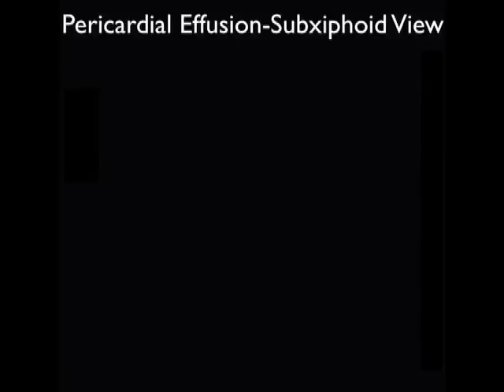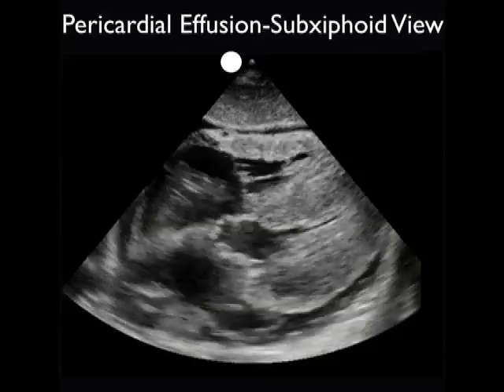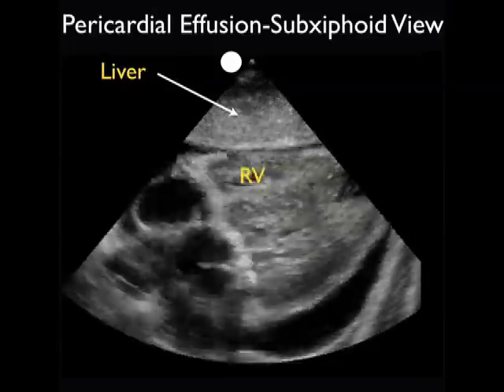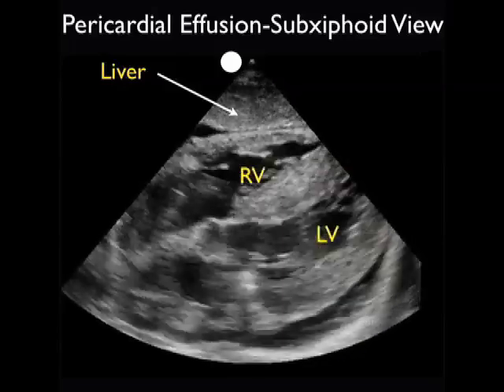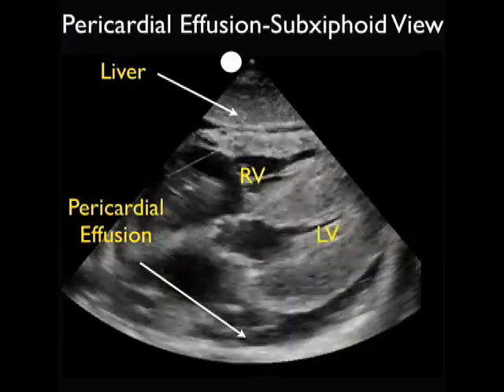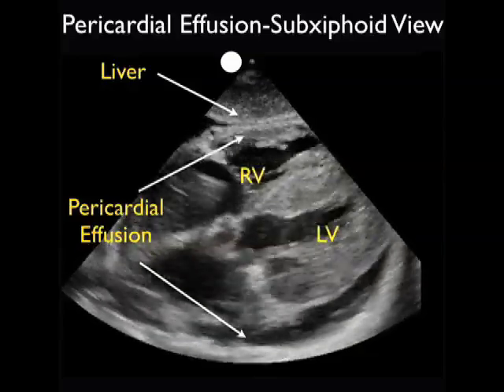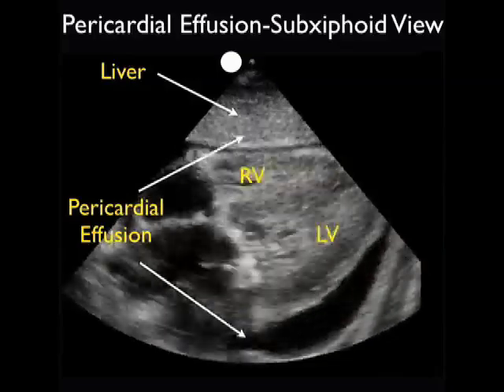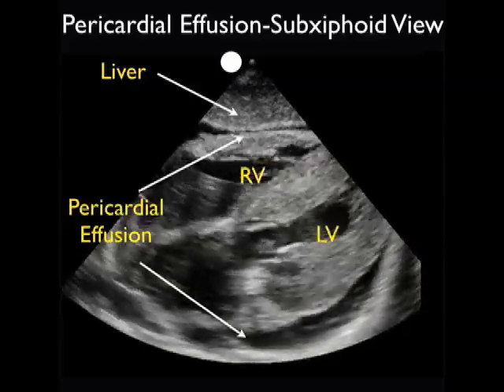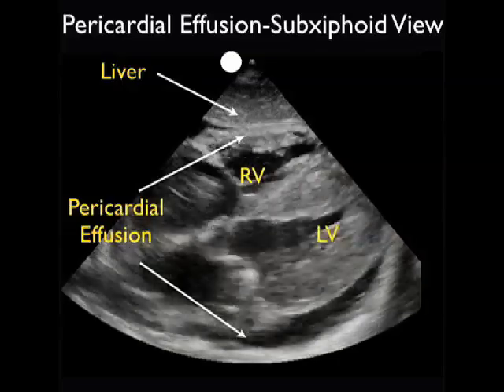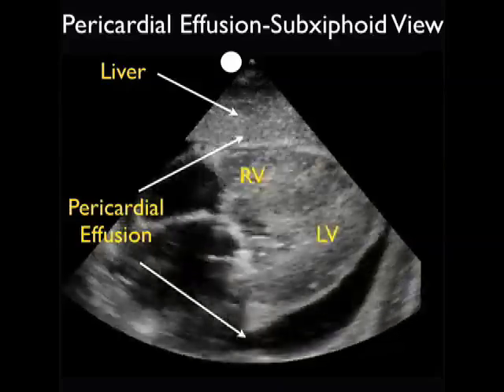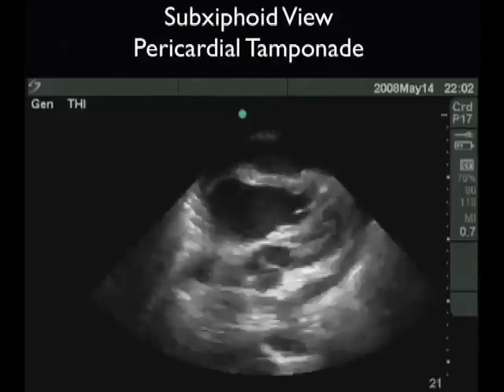Here's a patient who presented with renal failure and acute shortness of breath. Again looking from the subxiphoid plane, we see a strip of liver anteriorly, the right ventricle just below the liver, and the left ventricle posteriorly. Notice how hypertrophic the walls of the left ventricle are in this patient. We also appreciate a dark fluid collection both anteriorly just below the liver and above the right ventricle, and posteriorly below the left ventricle, consistent with a circumferential or large pericardial effusion. When we see a large pericardial effusion on bedside echo, our next move is to look for signs of cardiac tamponade.